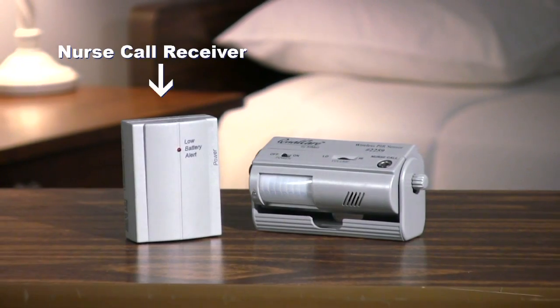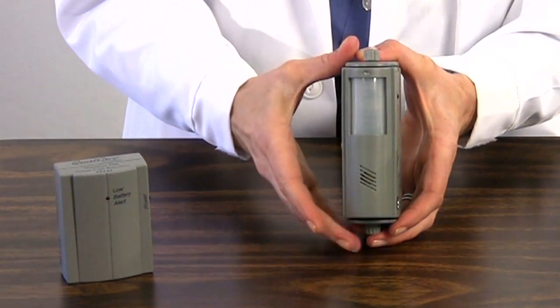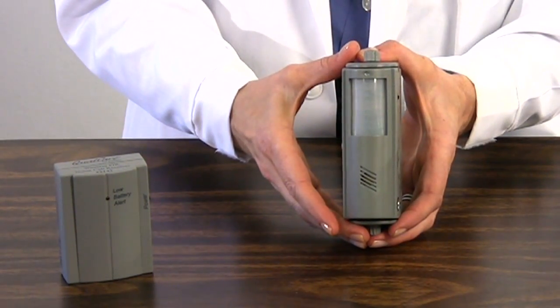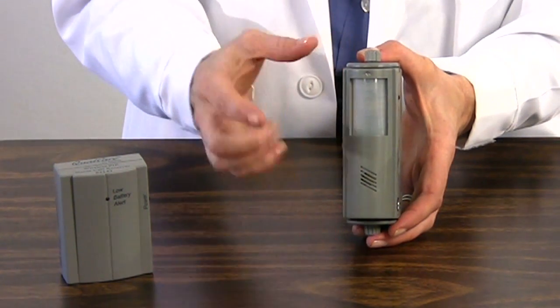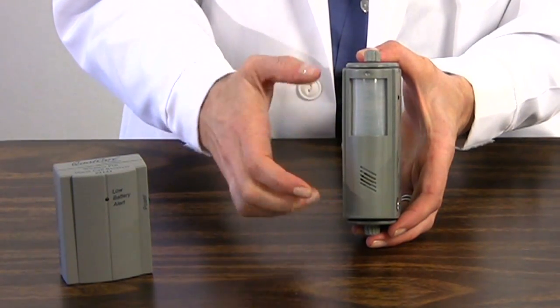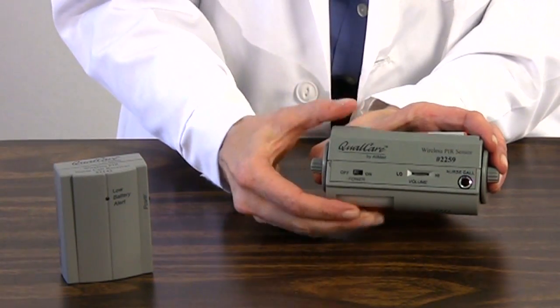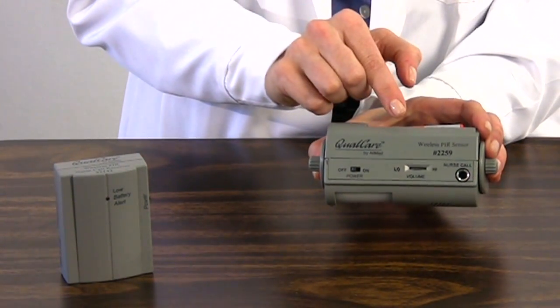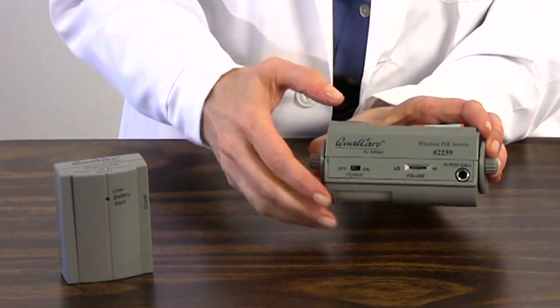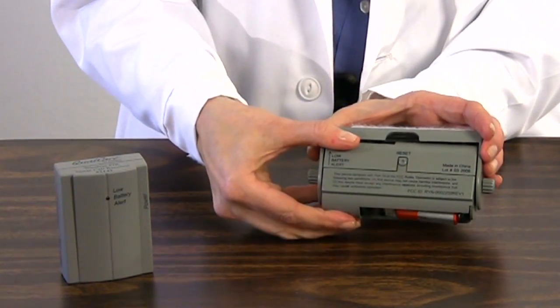On the front of the alarm is the sensing area — the part that emits the invisible infrared sensing beam. Be sure this is the side facing out when the alarm is in use. On the other side is the low battery alert light and the speaker where the local alarm sound is emitted. On one side of the unit are the alarm settings, which include the on-off switch, the high-low volume slider, and the nurse call jack. On the reverse side is the reset button. The unit swivels in the holster to expose the battery compartment.